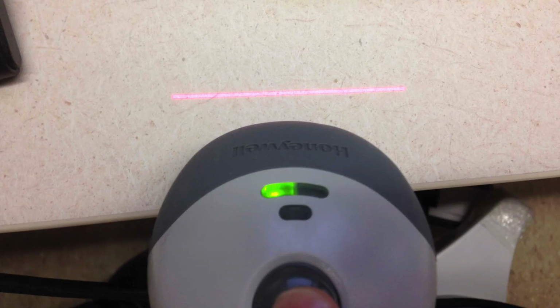Your first step is going to be barcode scanning the patient information into the ultrasound machine. And remember, if you have a patient sticker with information, the barcode is the ECD or FIN number, and we'll use that to identify the patient and drive the system.